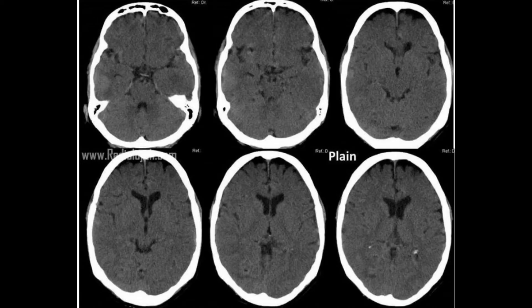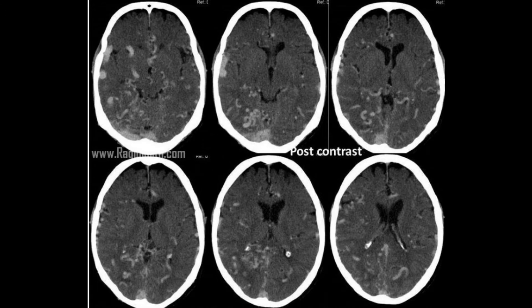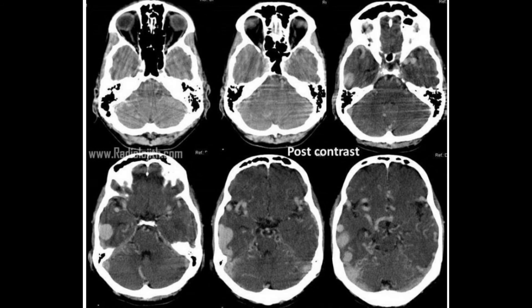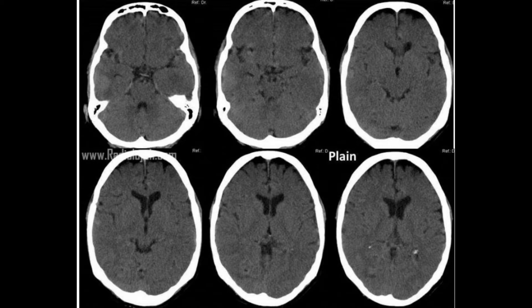Plain CT shows an ovoid hyperdense lesion in the lateral half of the right temporal lobe. After IV contrast, this turned out to be a large vascular nidus with mild perilesional edema around it. More prominent right sigmoid and transverse sinuses are also noted. In addition, multiple vascular collaterals are seen diffusely in the supratentorial and infratentorial brain, more pronounced in the right cerebral hemisphere. There is no evidence of mass effect or midline shift.